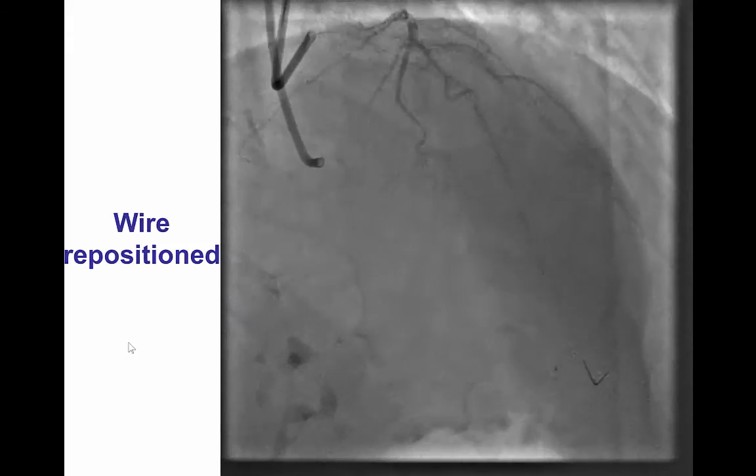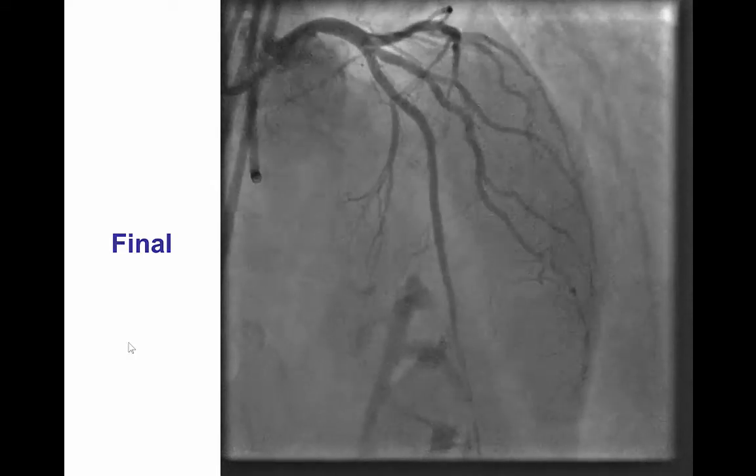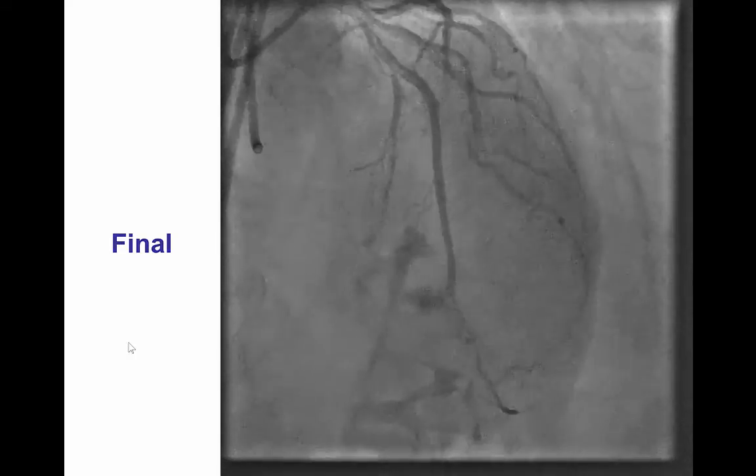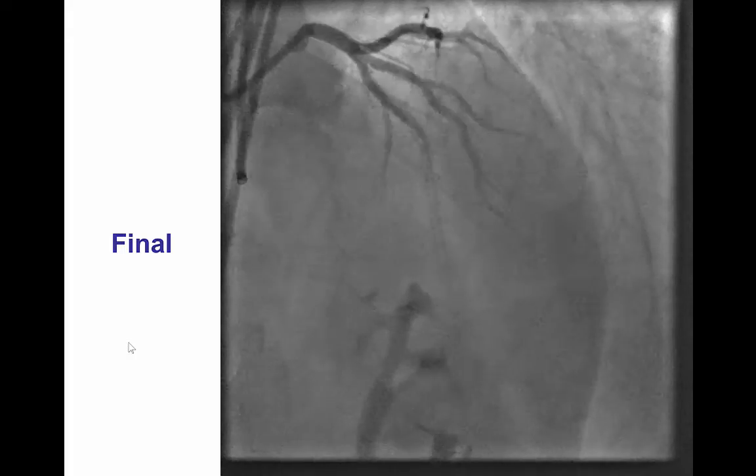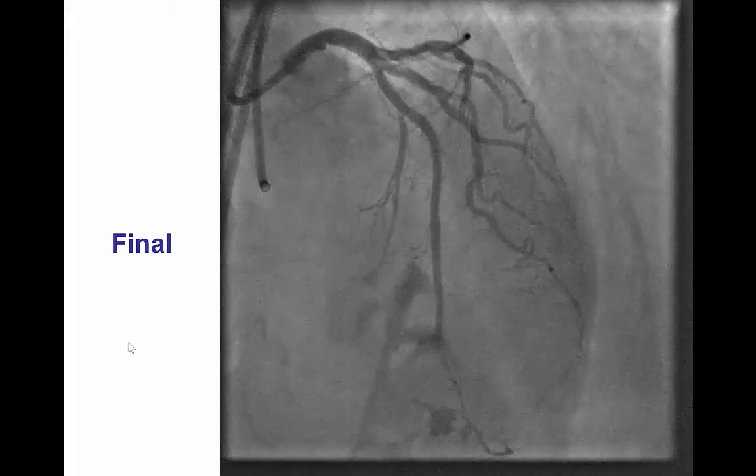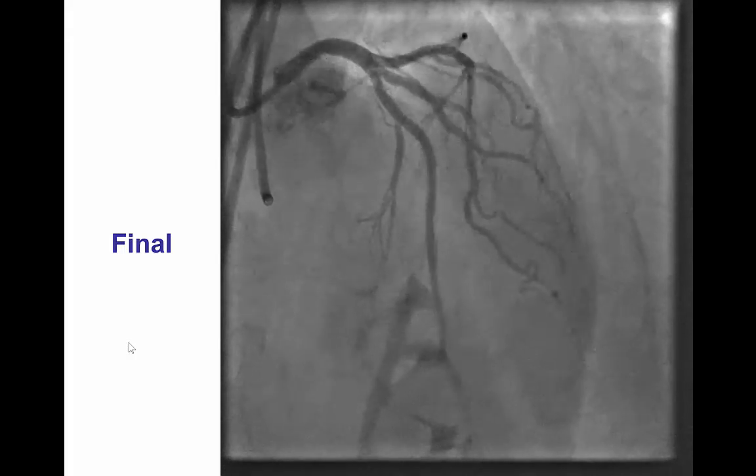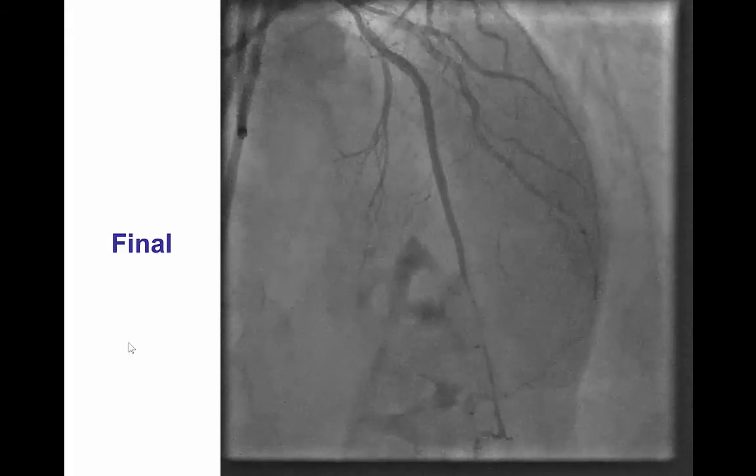The LAD guidewire was repositioned and after placement of drug eluting stents a nice final result was achieved with TIMI 3 flow in the LAD and no other complications.